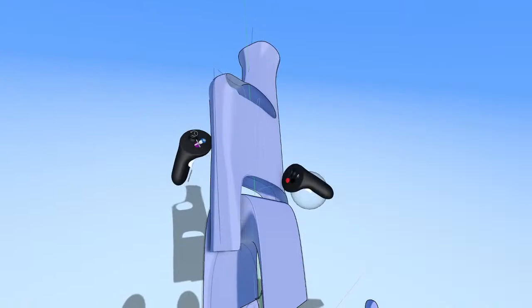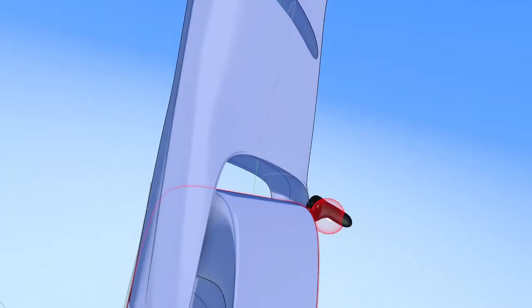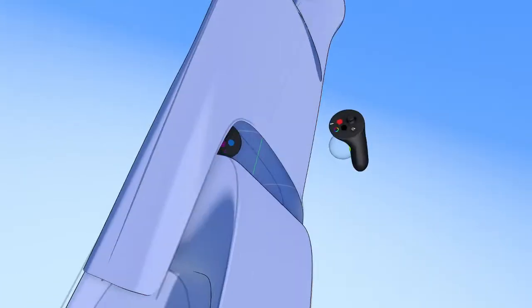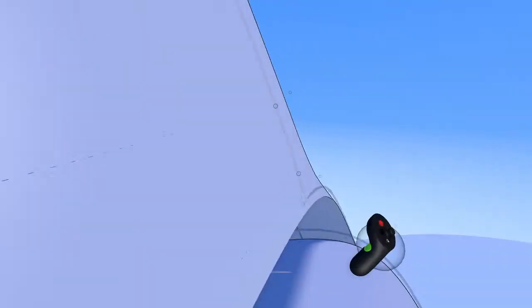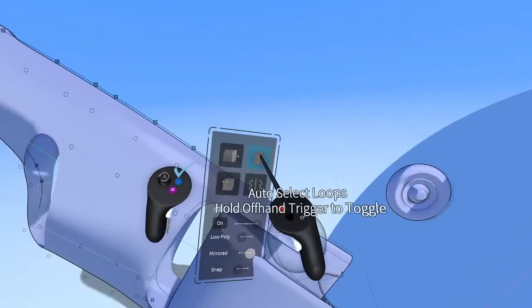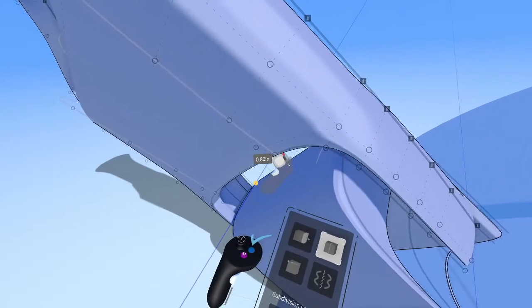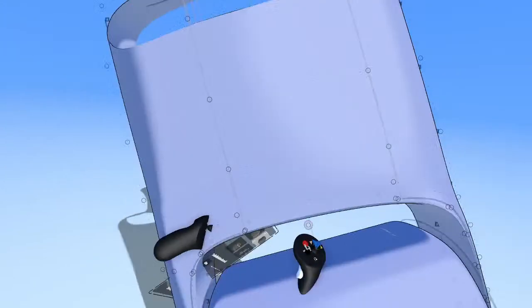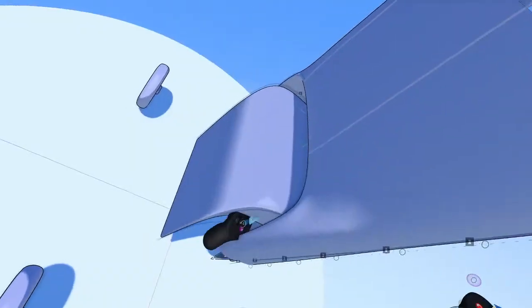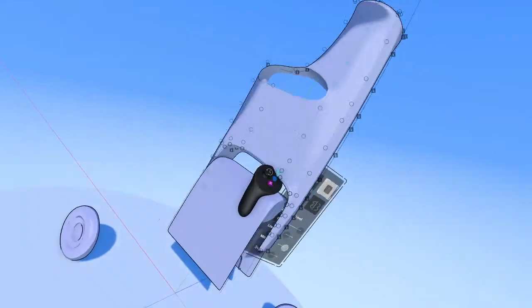All right, and the last thing I want to do on this top part here before looking back at our design is connect the bottom here. So we just have a shell right now, and I just want to fill this in here. So that's simple enough. We're going to turn on auto edge loop, grab this loop, hold it, press the pointer finger, duplicate it, and shift it in like that. It's a little difficult to see on the screen.